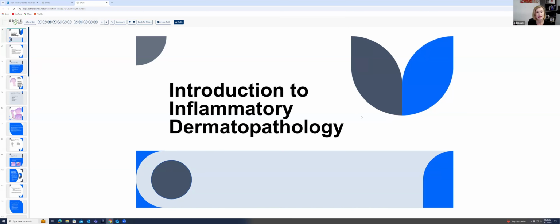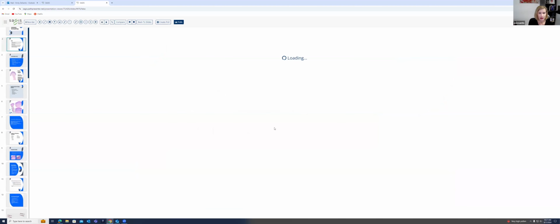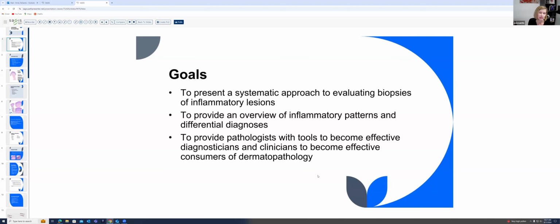I'm Dr. Emily DeSantis, and I'm going to be speaking today about inflammatory lesions and dermatopathology. This will just be kind of a broad overview of a few inflammatory conditions that we frequently see. It's not meant to be a comprehensive overview, but should certainly provide enough of an introduction that you get an idea of how we approach things under the microscope as dermatopathologists.